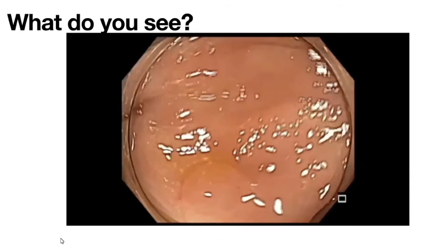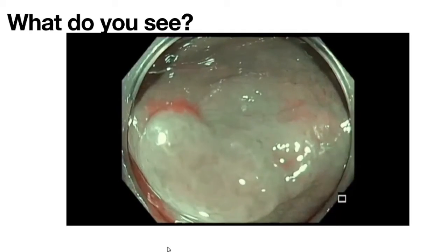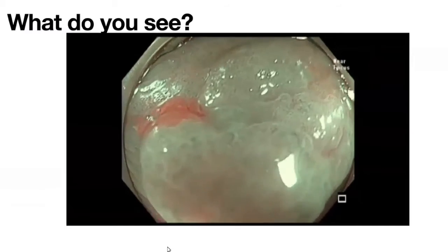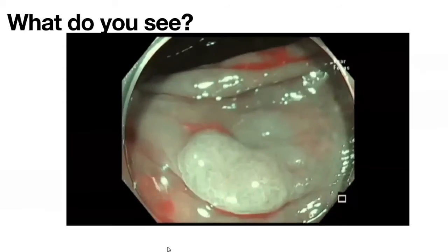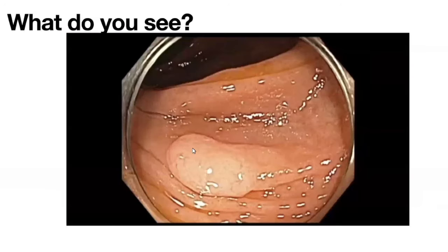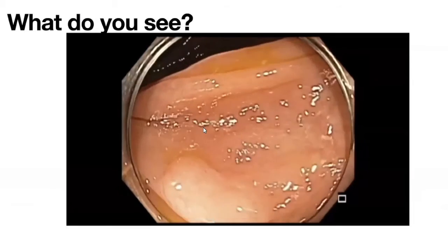So what I've done is I've taken this video and I wanted to play it a little bit better with NBI. And what do you think now? So NBI, can I answer? Yeah, please. Thank you so much. Thank you for joining. My pleasure. Thank you for the invitation. So it's similar color to surrounding mucosa and no vessel dilation and a very smooth surface. So I think this is SSL, hyperplastic polyp, I guess.